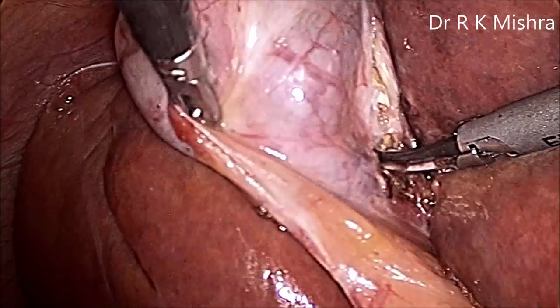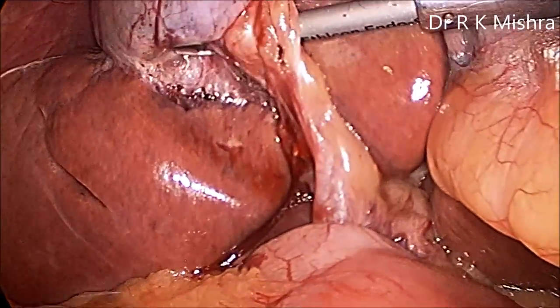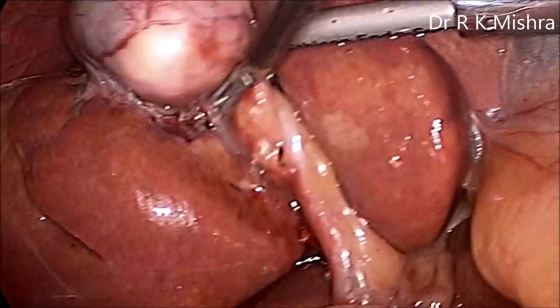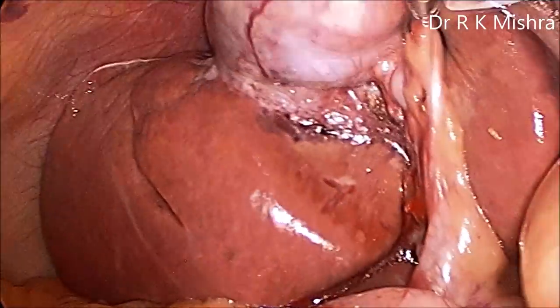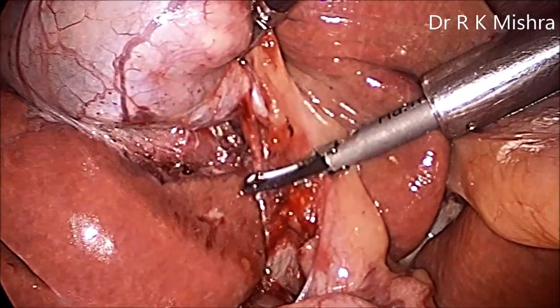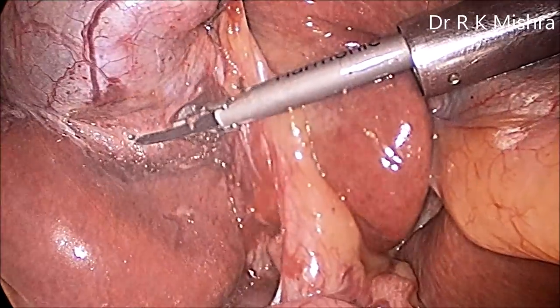Laparoscopic cholecystectomy is one of the most frequently performed procedures by general surgeons, but it has approximately 0.5% CBD injury reported, including beginners, novice surgeons, and experienced surgeons. So now the posterior peritoneum is dissected and we can see the inferior surface of the liver is clearly visible.